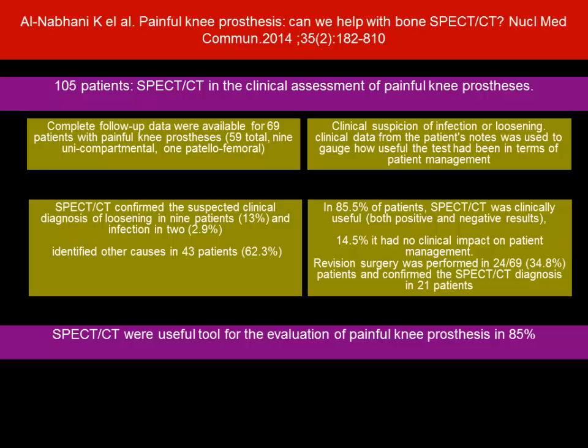In fact, about 40 to 50% of the patients after knee replacement will have patellofemoral arthritis, which I will come to later, because that will be the commonest cause of pain we often have to look for. Often we look only at the prostheses trying to find whether it's infection or loosening, but the main cause would be just patellofemoral arthritis in patients with knee replacement.